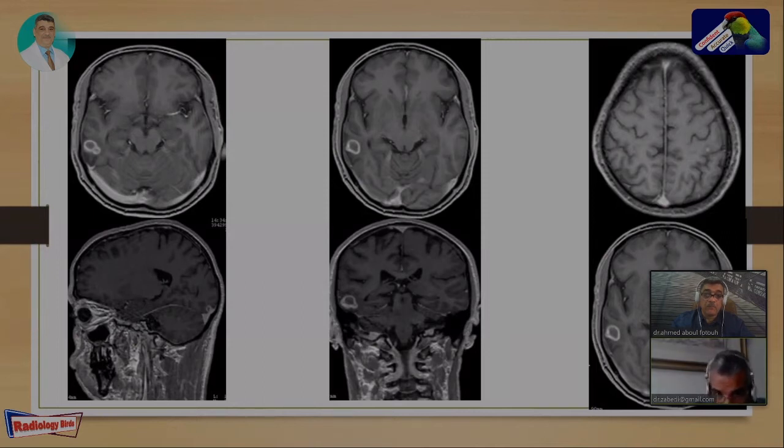The patient was, of course, in the ICU, and we were able to do the MRI without any problem. And this is the MRI. I think you will be surprised that this is completely different from the previous pictures, because in the native CT scan, I mean the CT scan without contrast, there is a hyperdense lesion, and it must not be bleeding. It can be, of course, the diagnosis was cavernoma and secondary bleeding of the cavernoma, but even when it's cavernoma and secondary bleeding, it will not cause the problem.